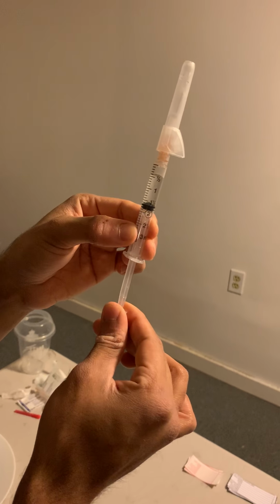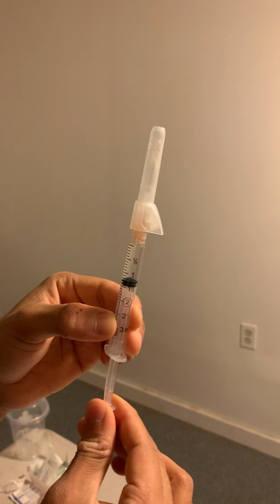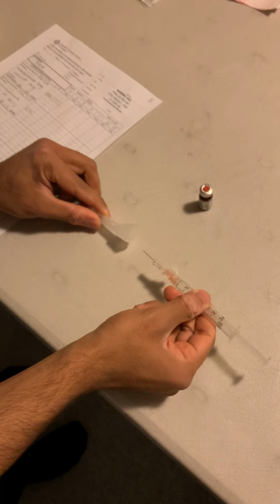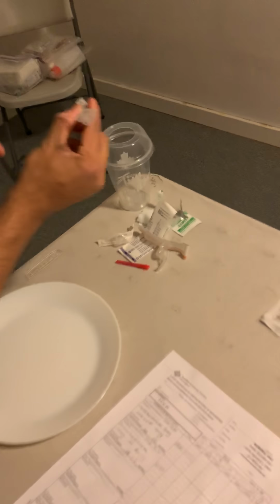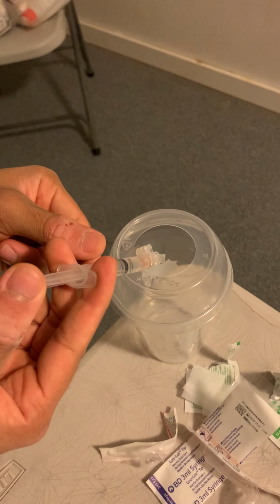I'm just going to be priming my needle now. I do have more excess, so I'm going to be putting that over my med waste container and getting rid of that. I'll be getting rid of what I don't need.